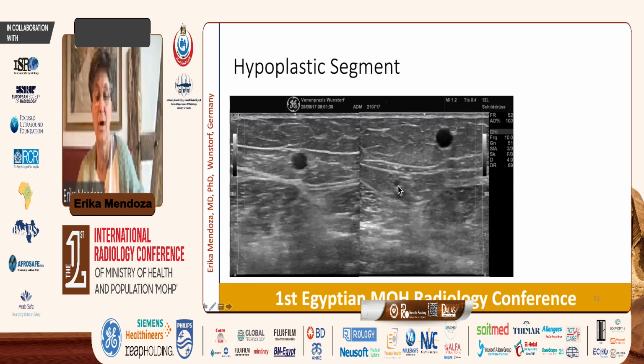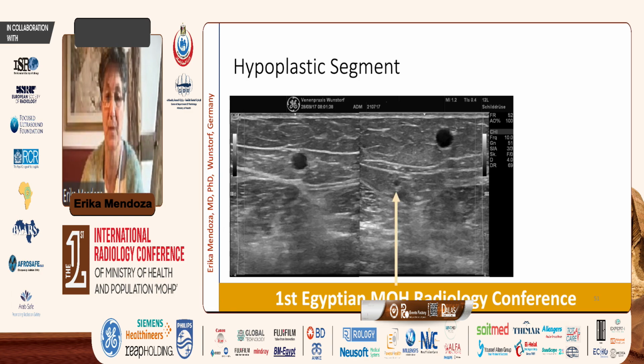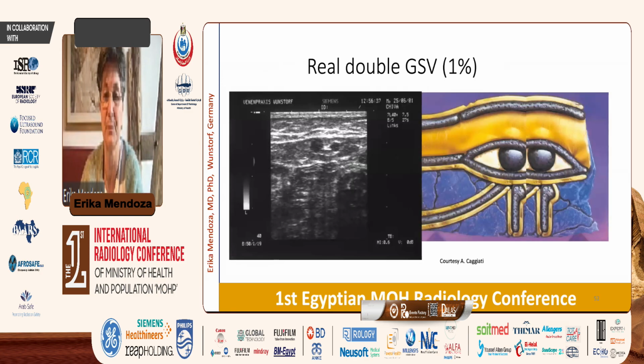Sometimes they were very keen at the beginning of ultrasound to define which is hypoplastic and which is aplastic. But it has shown that there is no differentiation. If you see any lumen, there is a saphenous vein, and you can deal with it. This is the hypoplastic segment.